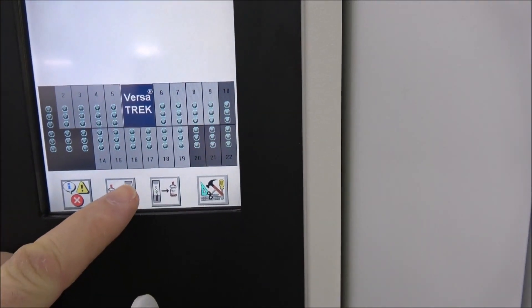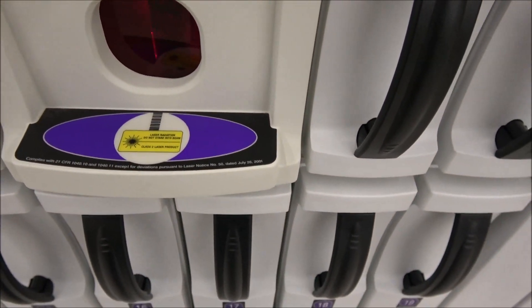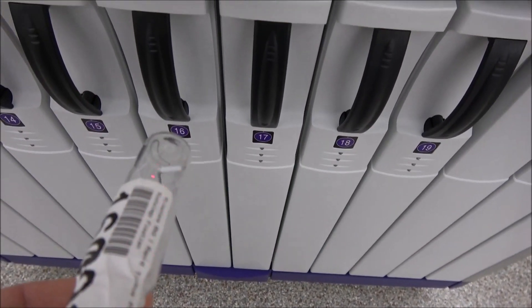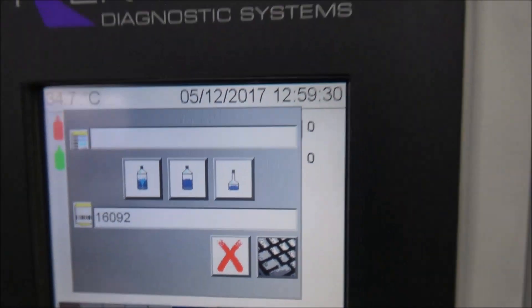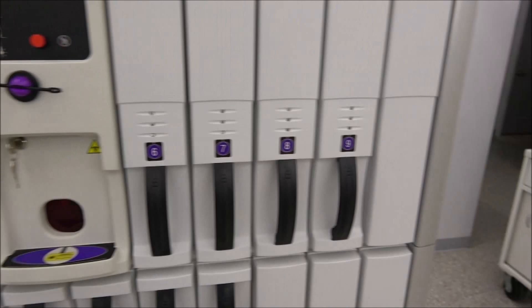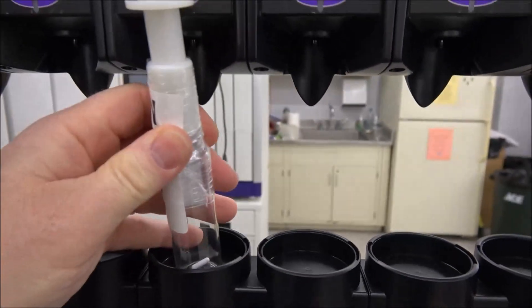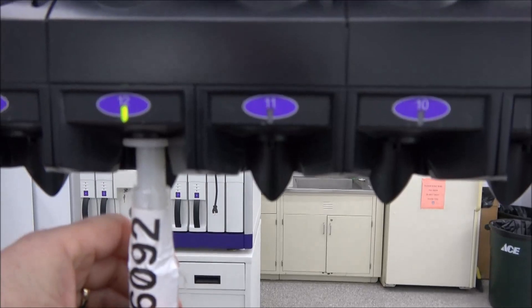First thing you would need to do is just touch the entrance, and then we get the bar scanner that kicks on down here. You can see it scans in there. We've got the barcode number in, and then we simply pick which bottle we want to go with. We've got our option with all the drawers, so we can just simply pick any drawer we want and install it — and it recognizes it there and now it's green.